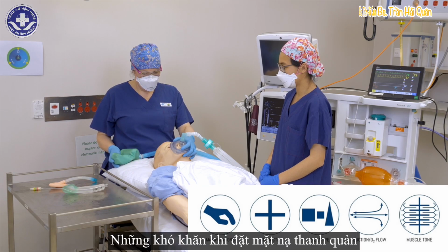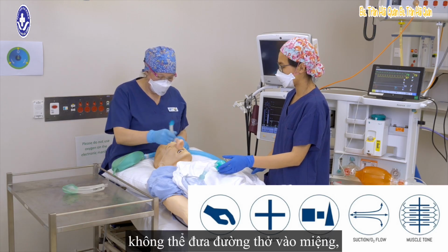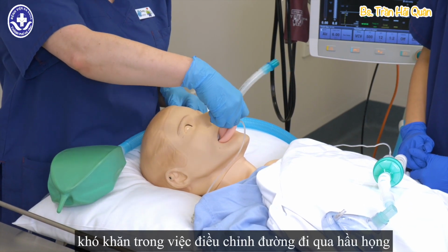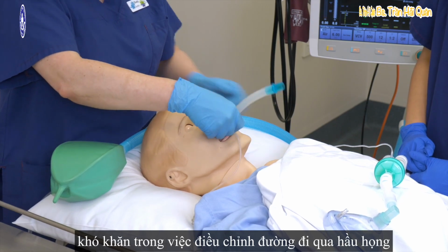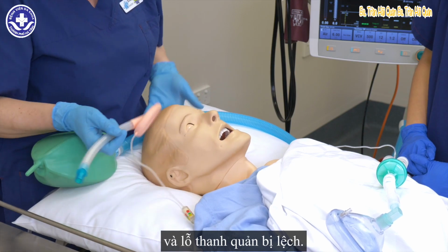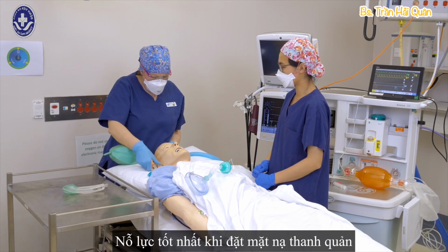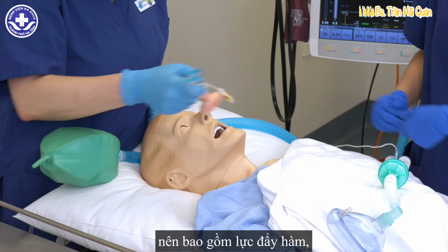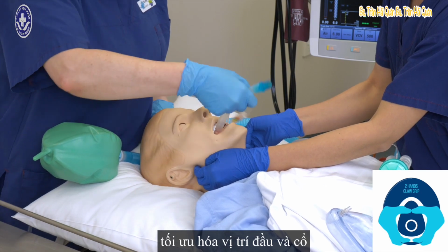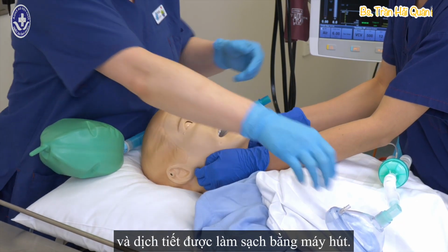Difficulties with laryngeal mask insertion can occur due to the inability to insert the airway into the mouth, difficulty negotiating the pathway through the pharynx, and misalignment of the laryngeal orifice. A best effort at laryngeal mask insertion should involve jaw thrust, optimising the head and neck position, and ensuring that debris and secretions are cleared by suction.